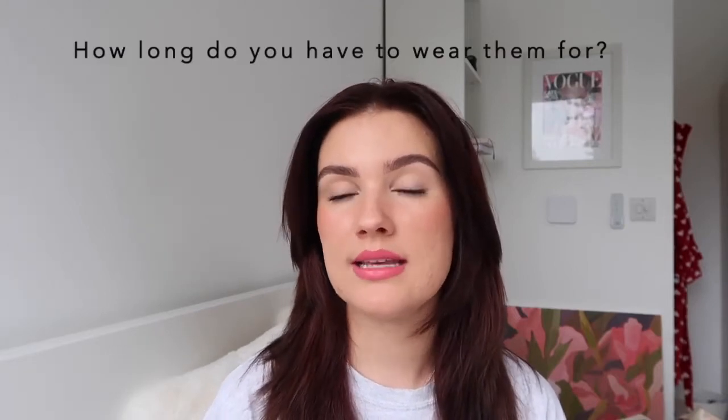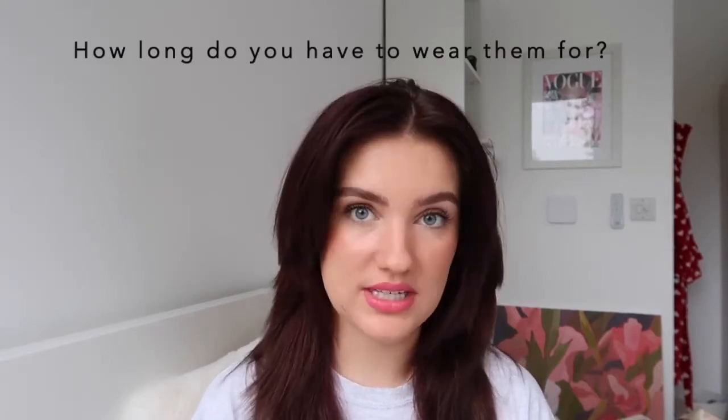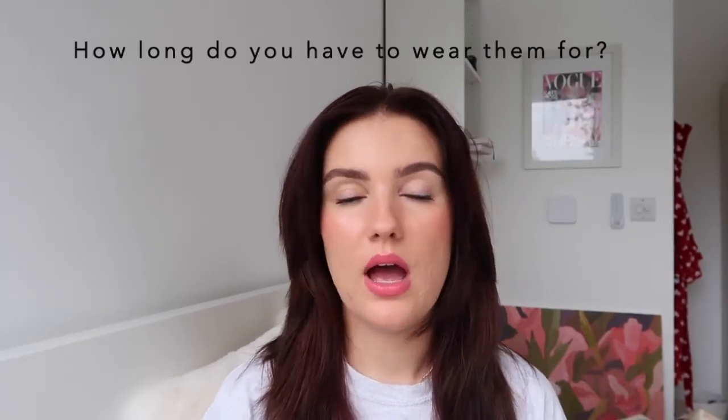Do you just wear them at night? The answer is you wear them for 22 hours or as long as possible, only taking them out for eating and drinking anything apart from water. You can obviously keep them in if you're drinking water, but anything else is going to stain the teeth.